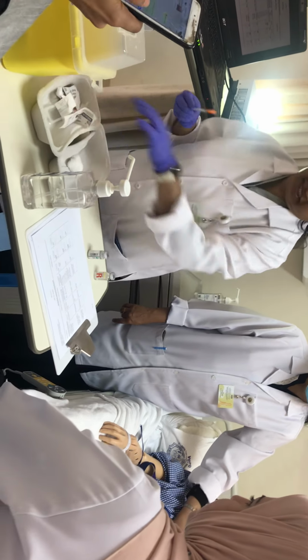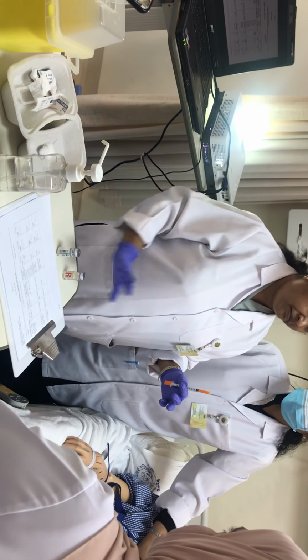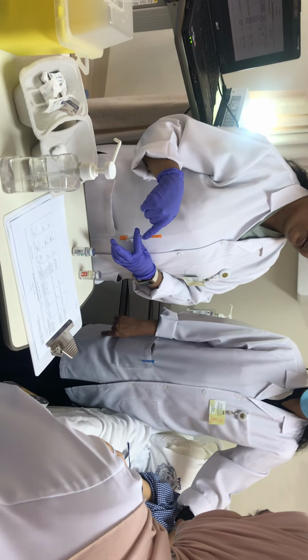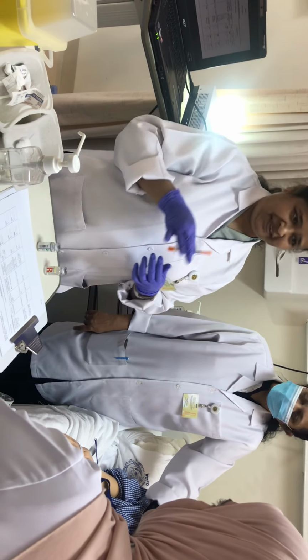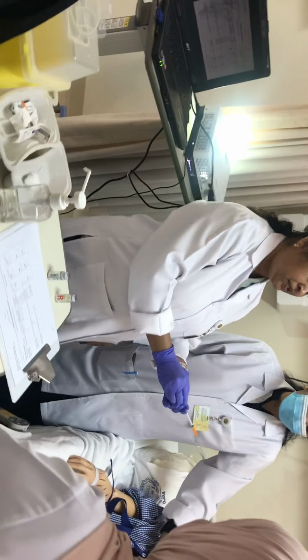Okay, by mistake, instead of taking 10, they took extra. With the first one it is okay, they can push it back. When they want to withdraw from the next one, they cannot push it back. They have to discard it and start the procedure all over from the beginning. Okay, remember that. So now it is 20 units.